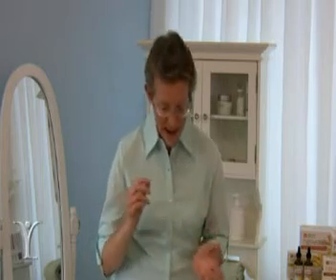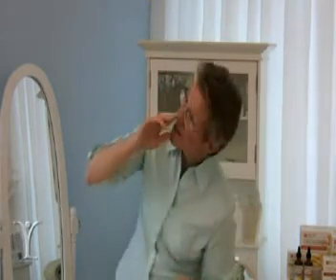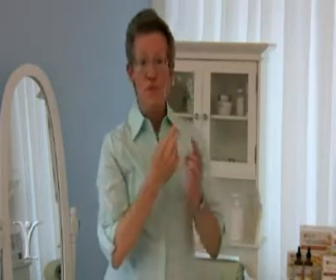Actually, the other things that can cause problems are if you put your head too far down, put your forehead too far down, you can get water up into your frontal sinus, which can cause a headache. And if you put the water in your nose and turn your head too far this way, too far with your nose up toward the ceiling, you can get water into your eustachian tube, the tube between your ear and your throat, and it can give you a sensation of having a plugged ear. But really, those are the only problems that people come up against with using the Neti Pot.